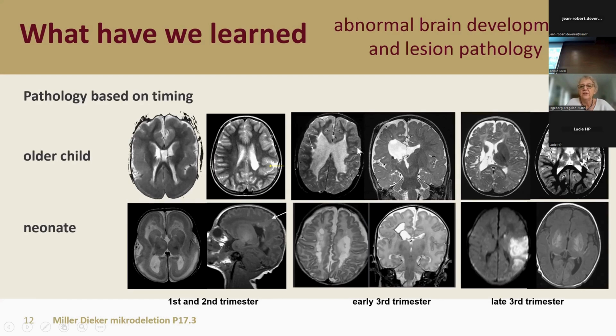And these are two examples of intraventricular bleeding also affecting the tissue. And at the end, there are typical late third trimester lesions, infarct, and then also lesions of the diencephalon, which usually originate from hypoxic ischemic situations around birth.